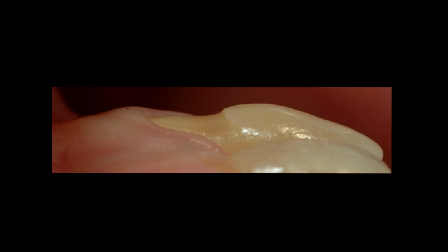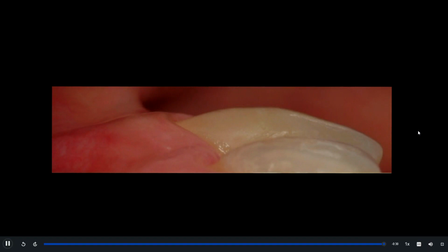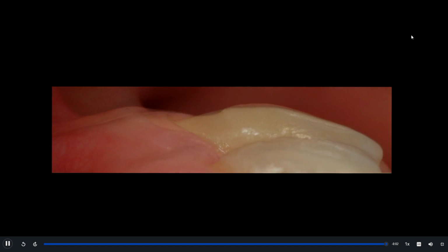And if you look again at what we call the sleeping tooth, and the situation before and after, you can see how much work was made in order to change patient expectations. So it's very important that we do all the restorative and surgical phases in the same setting, on the same day of the surgery, so the patient will not be aware how much of the success depends on the composite restoration and how much on the surgery. But what is very important is that the final outcome is really successful for our patient.